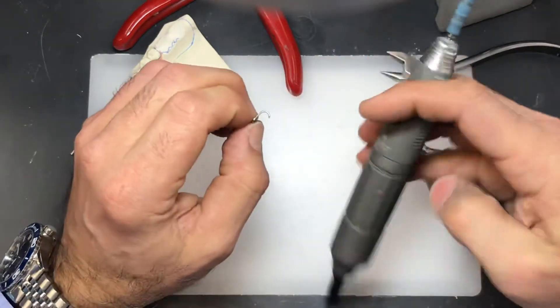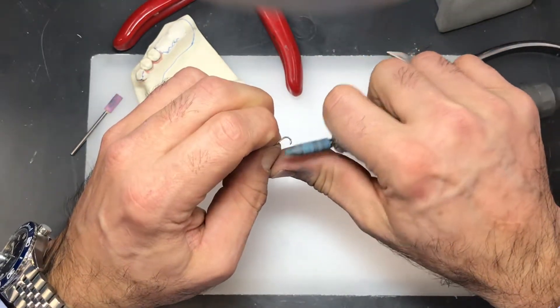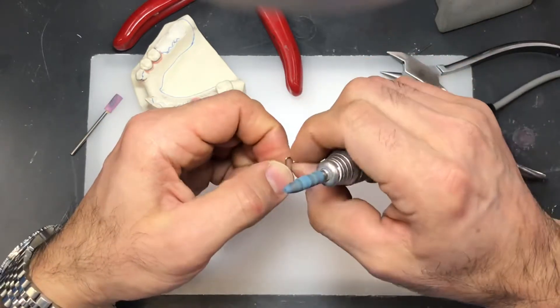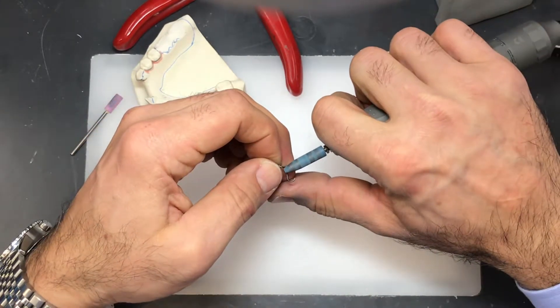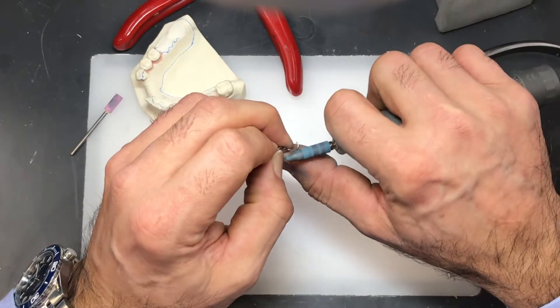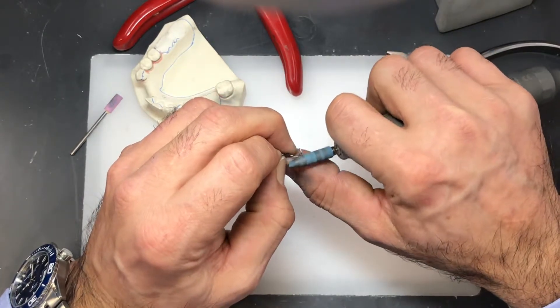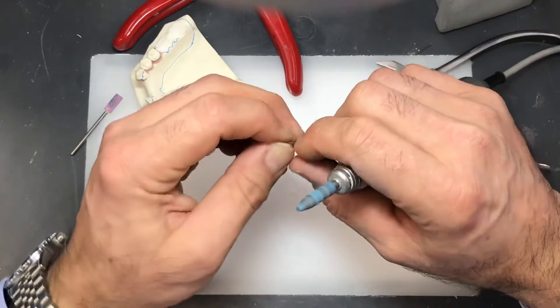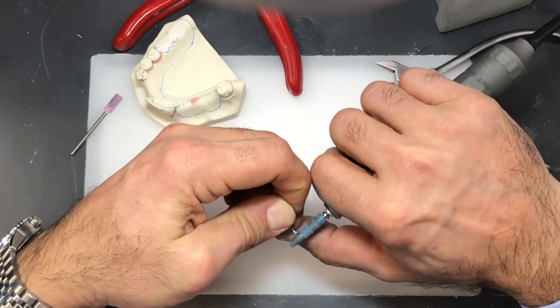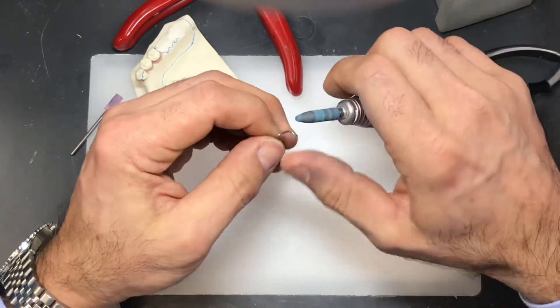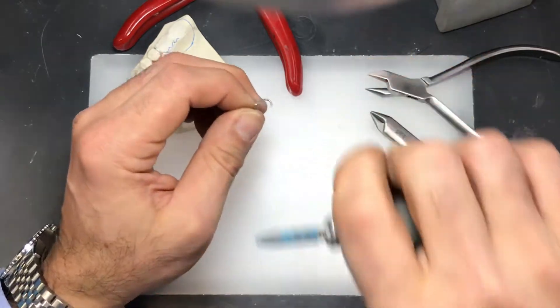I'm just going to go a little bit over the tip. Avoid polishing the wire on the inside where it's contacting the tooth surface because it's not going to fit the way you bent it anymore. A few nicks down here and that looks pretty good.